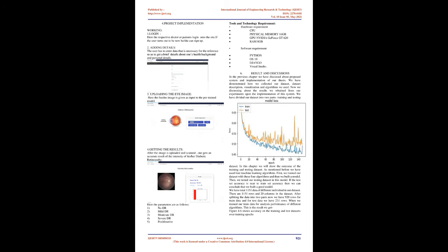In the training set, four different classification algorithms have been fitted to analyze the performance of the model. The algorithms we used are k-nearest neighbor, random forest, support vector machine and neural networks. After the system has finished learning from the training datasets, newer data is provided without outputs. The final model generates the output using the knowledge it gained from the data on which it was trained. In the final phase, we get the accuracy of each algorithm and get to know which particular algorithm will give us more accurate results for the prediction of diabetic retinopathy.